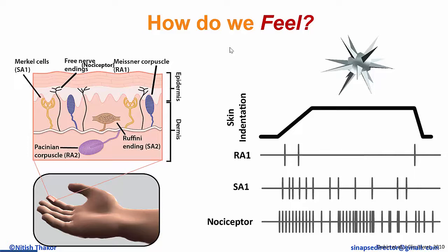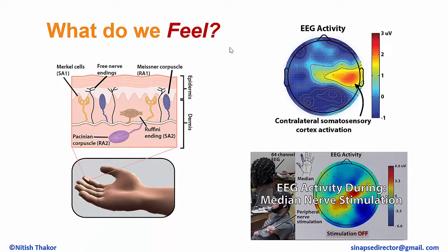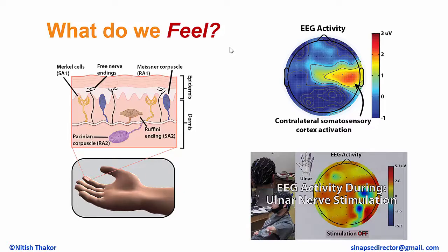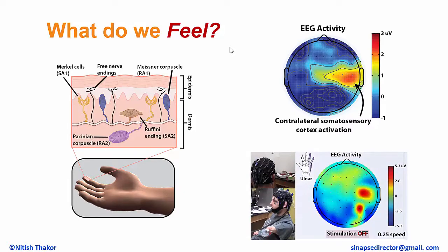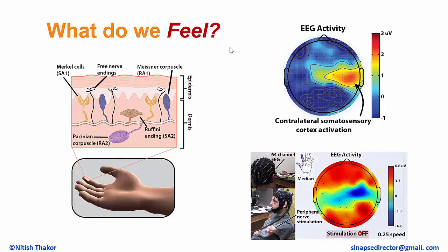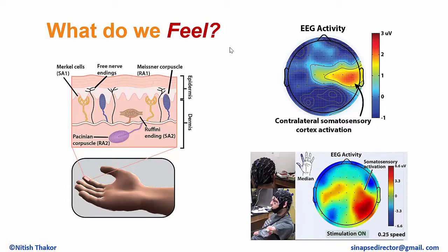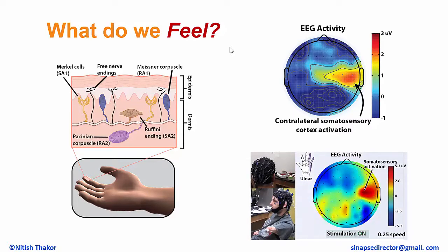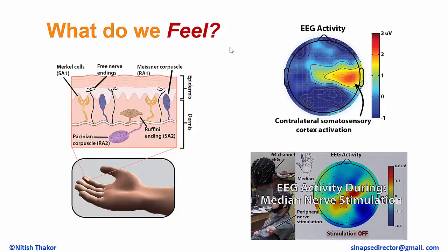But really, do we know? So we need to go to the brain. So we did that actually. We recorded the brain signals. So it shows on the upper right-hand corner is the map of the brain, and the right side in the middle is the part of our brain that is the somatosensory cortex. It's the part of the brain that is movement and touch. In the lower right-hand is the video that shows the graphic changes in the brain signals. But this is very beginning. I mean, how does the brain sense and feel? This is ongoing research, but maybe that's how we'll understand what goes on in our brain or goes in our mind.